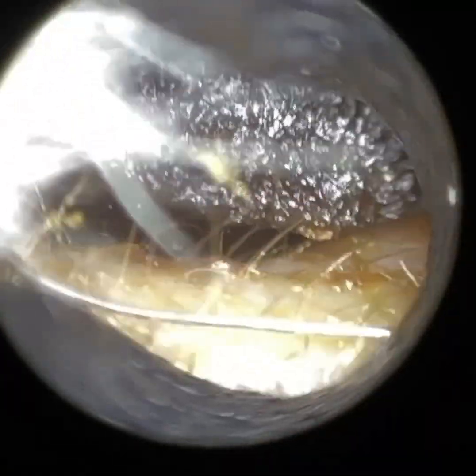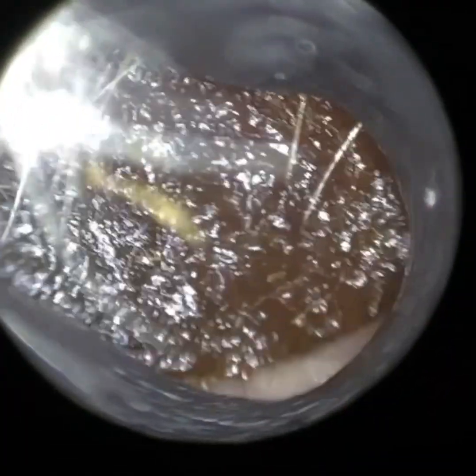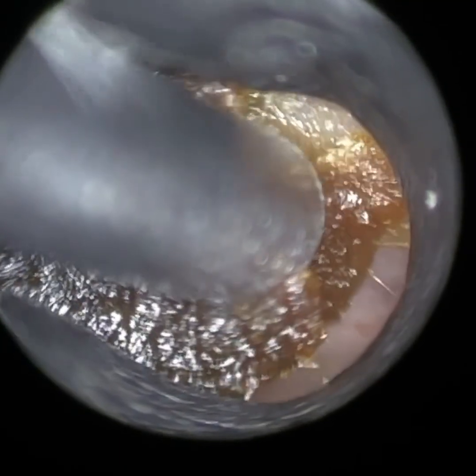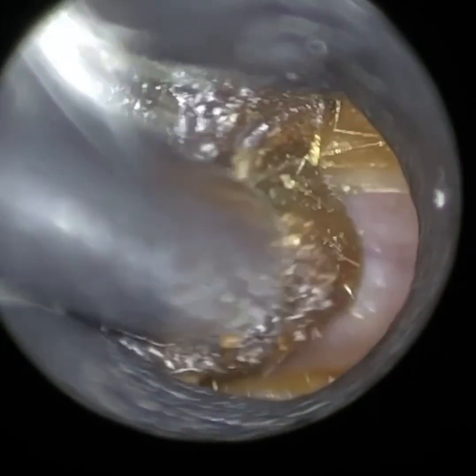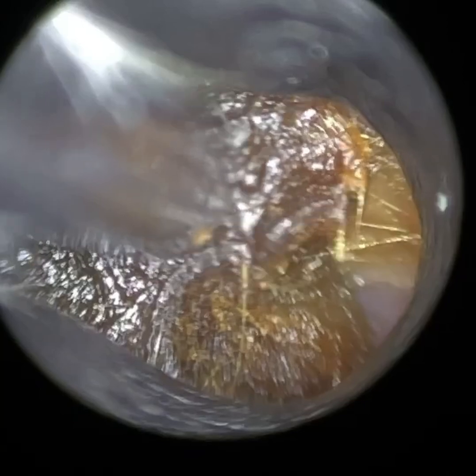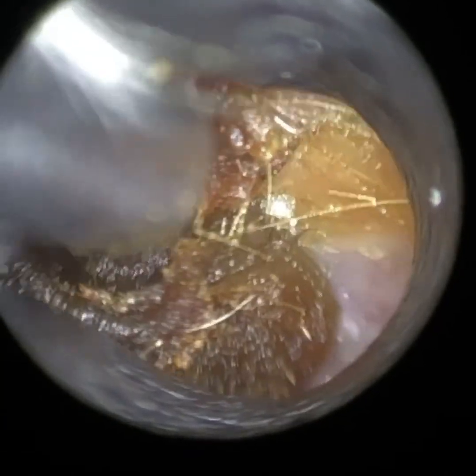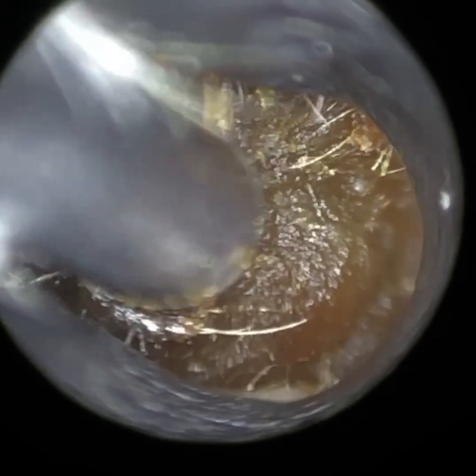Hi everyone, this is Mr Neil Reiteter, consultant audiologist and director of Clearwax. Thank you for joining me in what is another demonstration video of our recently developed Waxscope. This video is performed in a patient with a very, very narrow ear canal and also a very bendy ear canal. This wax plug extends all the way from the entrance of the ear to the patient's eardrum.